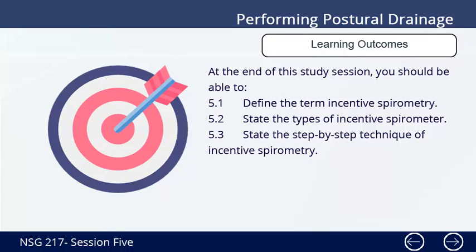Learning outcomes. At the end of this study session, you should be able to: 1. Define the term incentive spirometry. 2. State the types of incentive spirometer. 3. State the step-by-step technique of incentive spirometry.